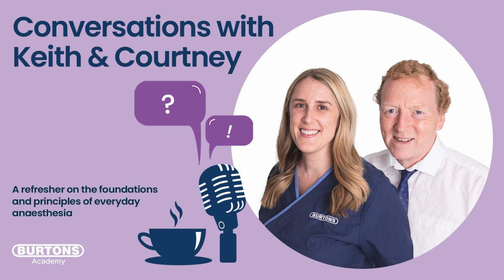Yeah. The ones I'm familiar with, and especially the non-EM probes that work really well, they'll go down there. They're about the same size as your thumbnail, really, aren't they? Those probes, they're quite convenient. Even smaller than that, really. Yeah. About 7 millimeters by about 5 millimeters, something like that. About 3 to 4 millimeters deep. Yeah, they're quite small.